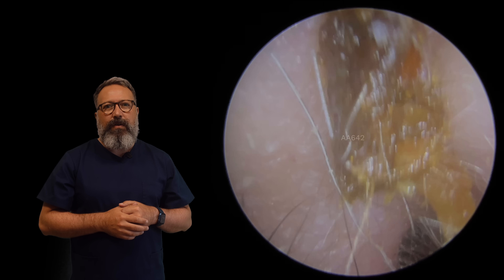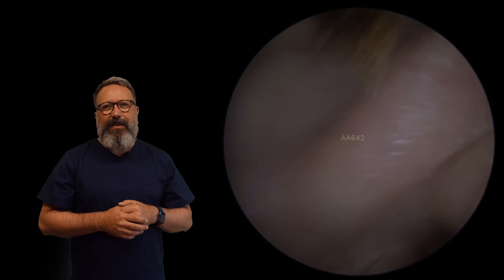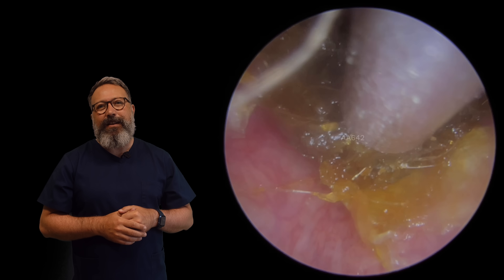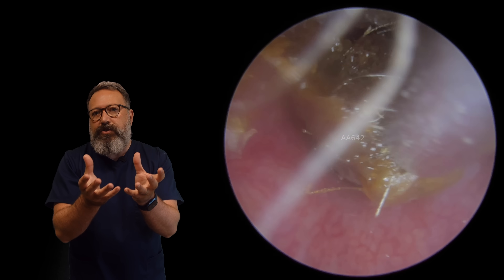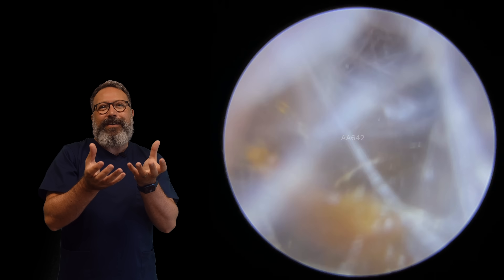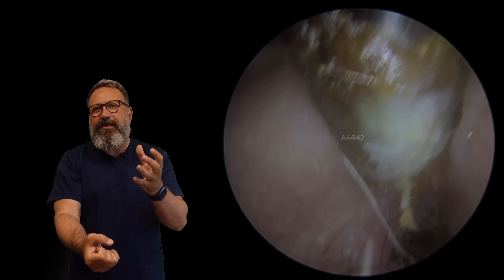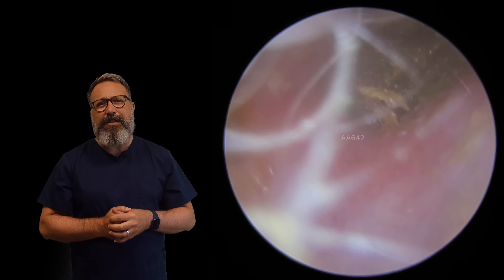Let's start to drop this next section — you can see just how dense those cilia are once we get to the outer part of the ear canal. There we go — none of these pieces are small pieces. I told you it was tough as old boots! Going in just a little bit further now — you can see that layer of dry skin that's formed around this wax plug. Just going to lift this up and get a bit of wiggle involved, starting to wiggle it out, detaching it from the canal wall. You can see that dry, cream-coloured skin underneath — that's a layer of dry skin.